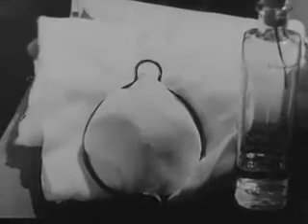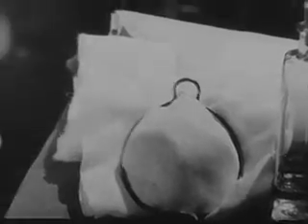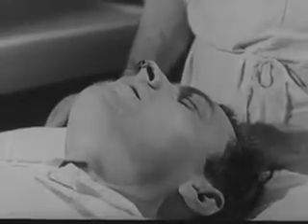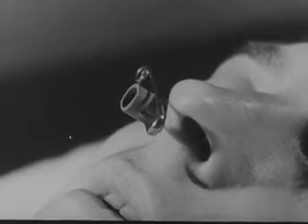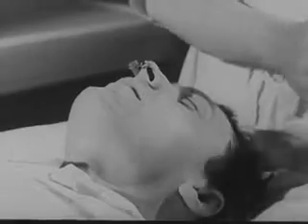or by means of an ordinary mask and ether drop bottle when the anesthetist has free access to the patient's face. In this case, the metal connection may be discarded and the endotracheal tube is transfixed by a safety pin to prevent its disappearing down the nose.